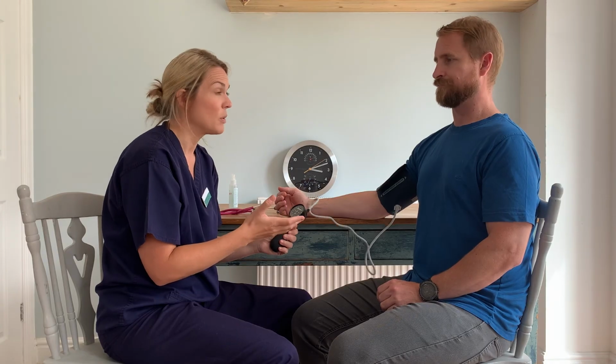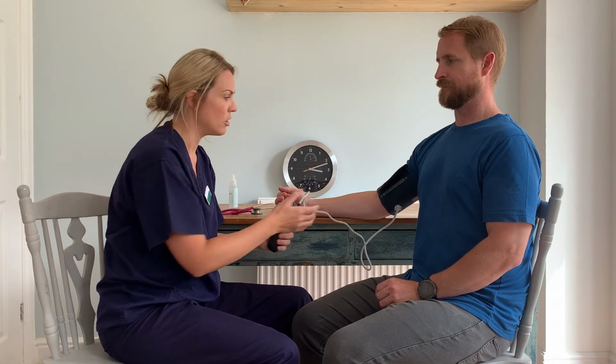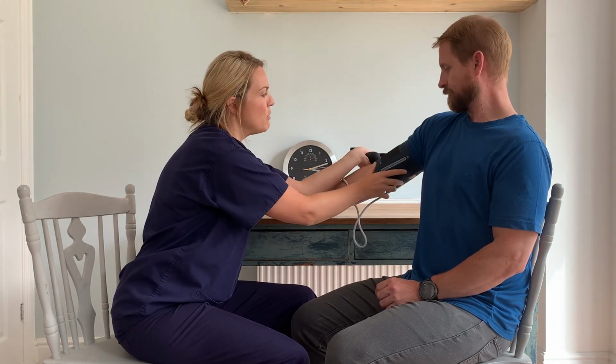So Daniel's is 118 over 62. So that was perfectly within normal range. That's good. That's what we were expecting. I can remove the cuff now. I can clean all of the equipment again, wash my hands, and that concludes the blood pressure taking.